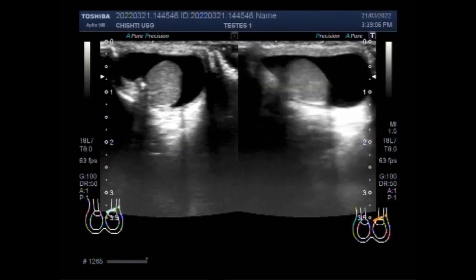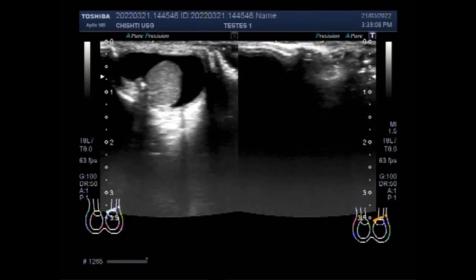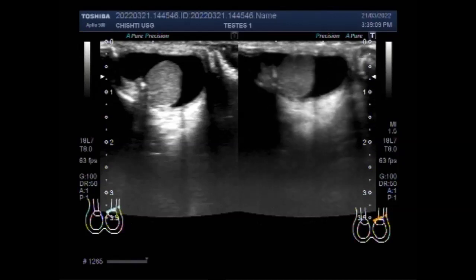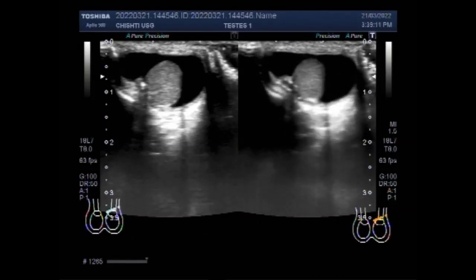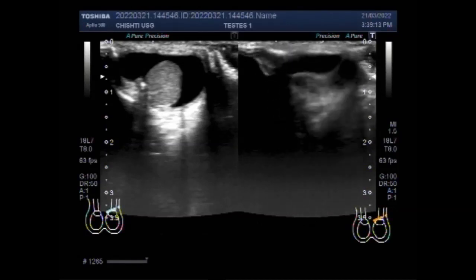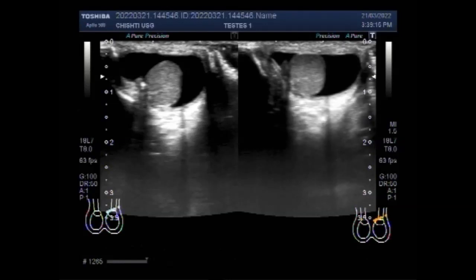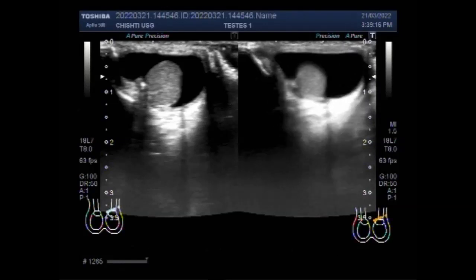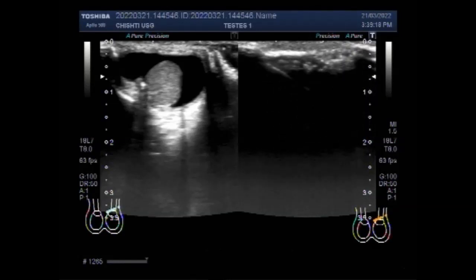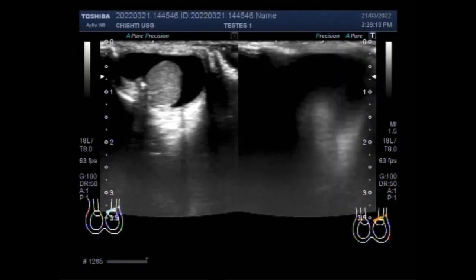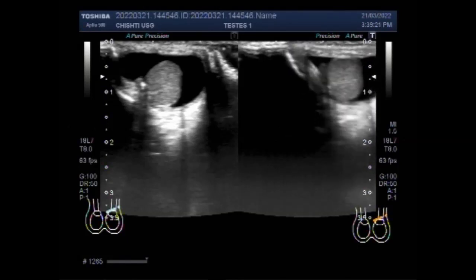Now you will see the gut loops — a small portion of gut loops is seen in the hydrocele portion of the scrotum.